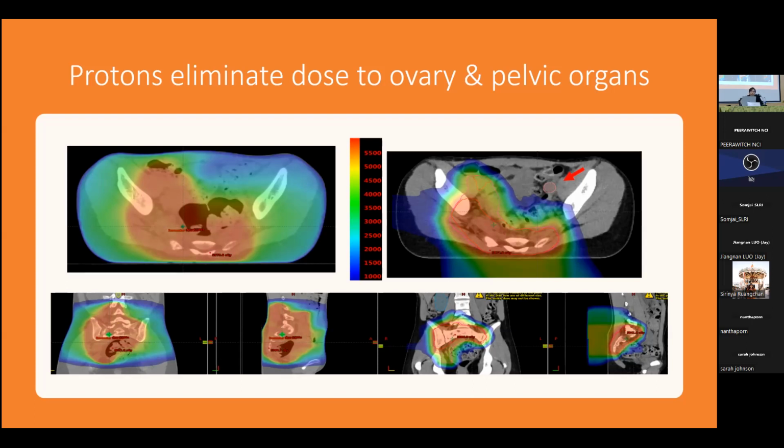But here, and one thing that some would actually do is a kind of transplant of the ovaries. So you had to do a surgery, move them out of the way of the radiation, and then afterwards put them back. So that's surgeries, and there are always possibilities of complications with surgeries. Here you can see we totally spared one of the ovaries, so there was no need for that surgery or going through that extra expense.